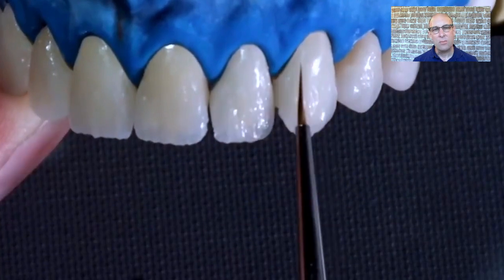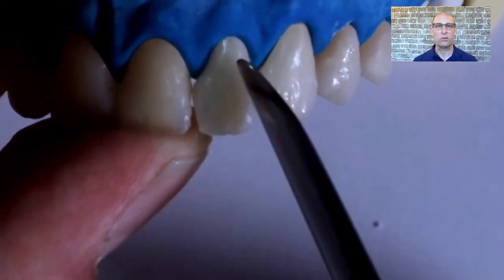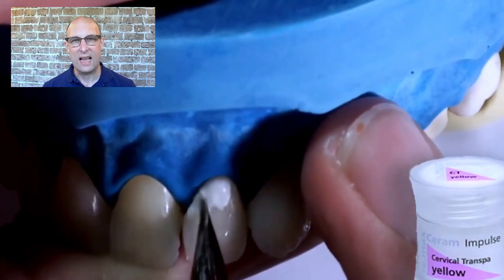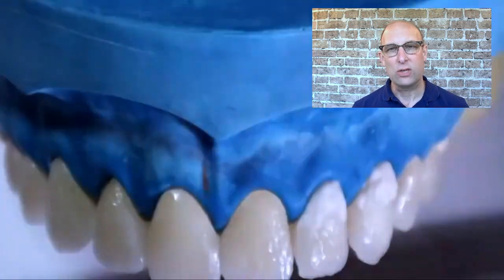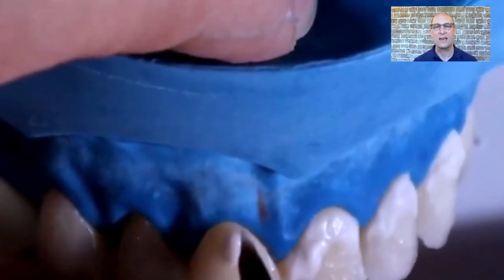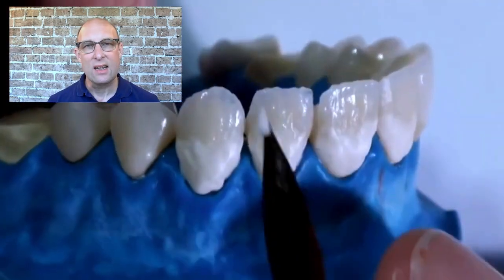Now I'm ready to build up the second bake. You might notice that the central has more chroma than the lateral and canine — I added more stain during the wash bake to demonstrate how to solve this issue. One way is to fire another stain bake 10 degrees lower than the dentin bake, but to avoid that additional bake I'm using Cervical Translucent Yellow, which has just the right amount of color to bump the chroma up slightly while completing the tooth shape. I add Cervical Translucent Yellow only at the lateral and canine in a thin, even layer. At the central I use a very thin layer of OE5 to increase the chroma slightly while completing the shape. OE5 is in the opalescence family but is slightly yellow and orange.